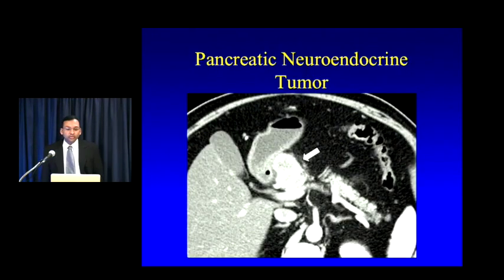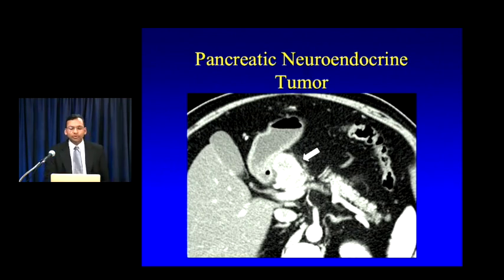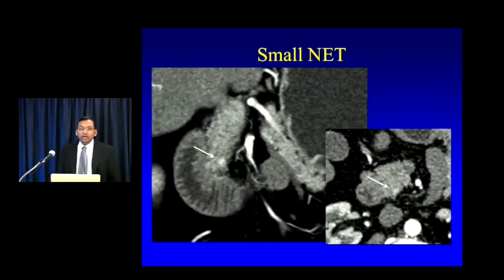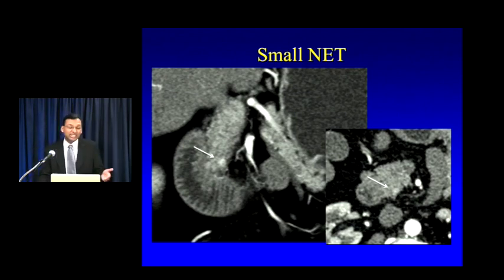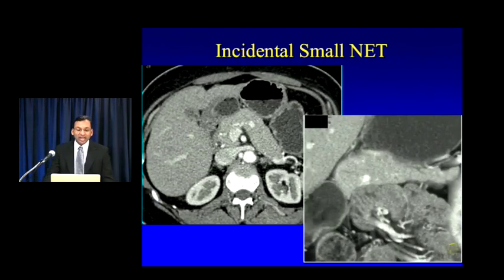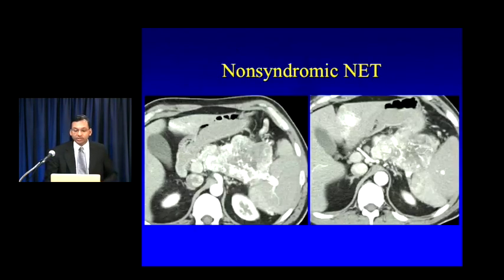Here's a classic pancreatic neuroendocrine tumor — well-circumscribed, well-marginated, with avidly hypervascular enhancement on arterial phase images and absolutely no upstream pancreatic atrophy, which would be quite unusual for an adenocarcinoma in this location. We're increasingly identifying small neuroendocrine tumors incidentally as we do more arterial phase imaging — here's a small incidental NET, probably six to seven millimeters, found in a patient being scanned for a renal mass. Another example illustrates that you still need to look for hypervascular lesions on the venous phase, as some NETs are diagnosable there as well.